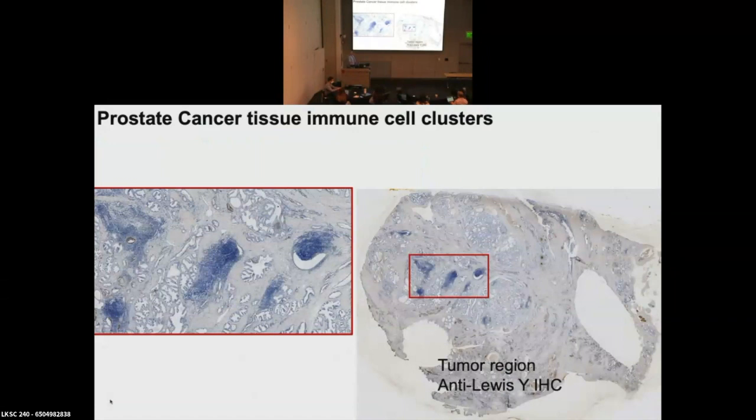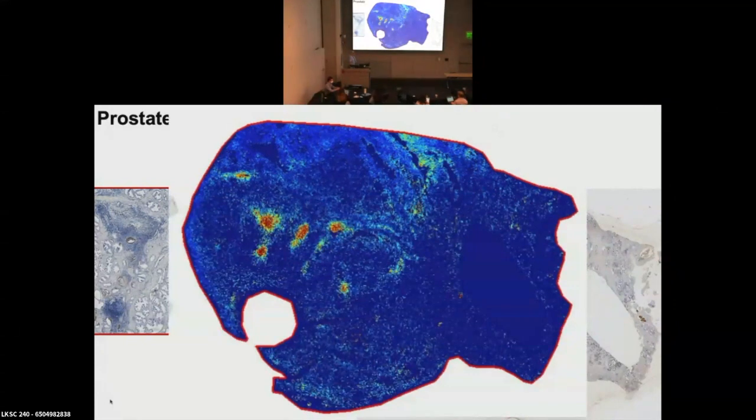But then I started looking at this prostate tissue, which is the one that struck me. There are so many other things you could look at. The little immune clusters in most tissues we just weren't looking for anymore, because most of the time we didn't see anything. And then this one popped up, and it was, if we're ever going to see an immune cluster glycome, that's this one. And we did.